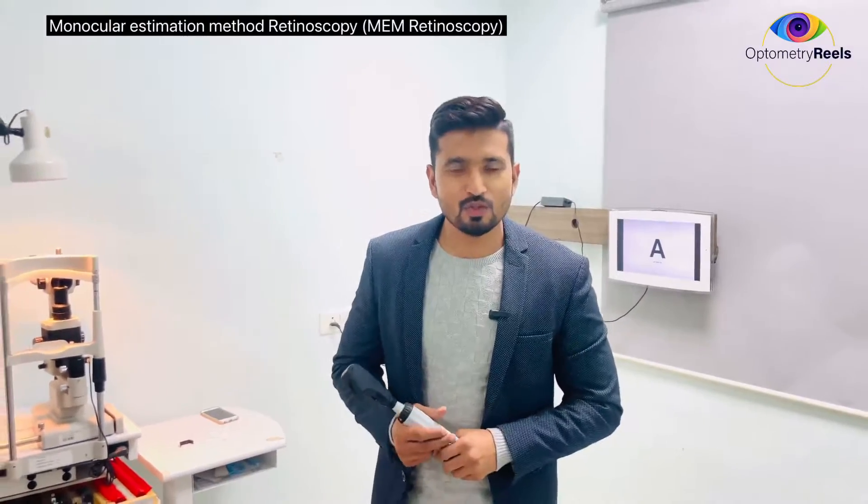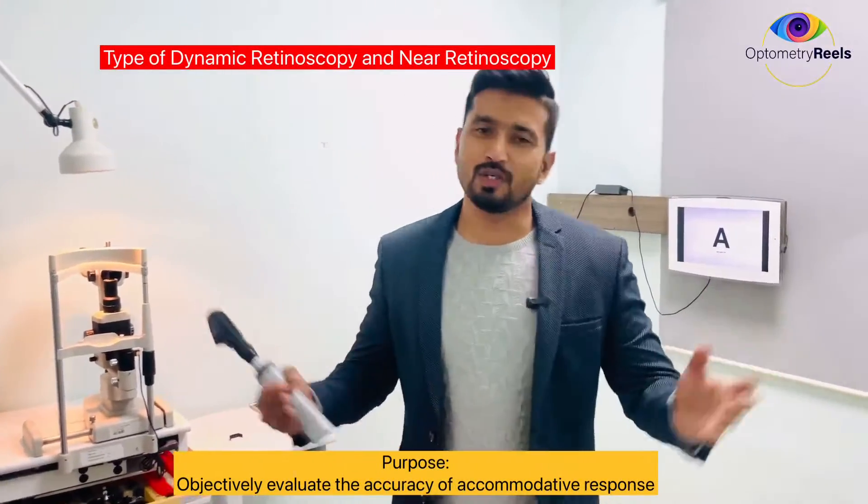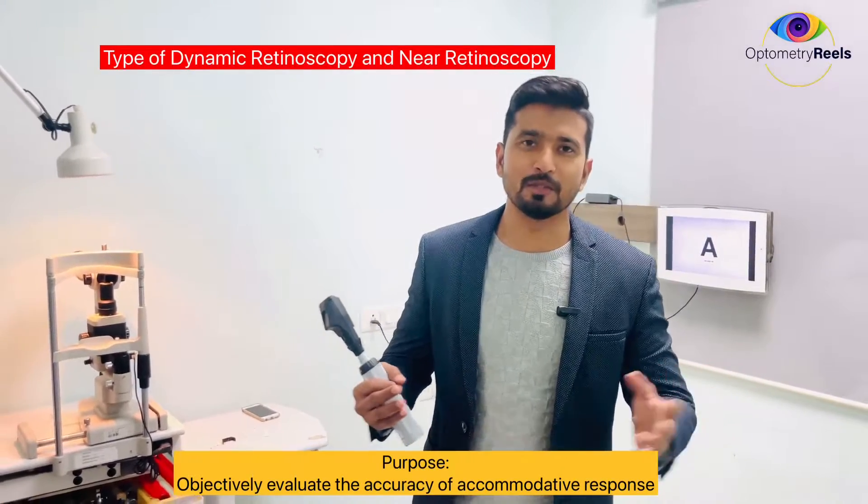Hello and welcome to OptoMaterials. I am Dr. Noor and today we are going to learn one more important technique of retinoscopy which objectively evaluates the accommodative response. We are going to learn about the monocular estimation method, which is a near retinoscopy that measures the dynamic response of accommodation, so it is also known as dynamic retinoscopy.